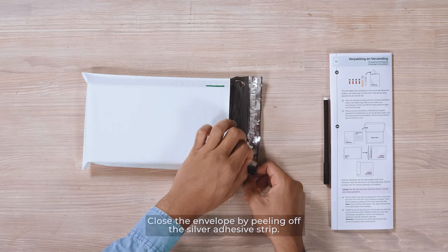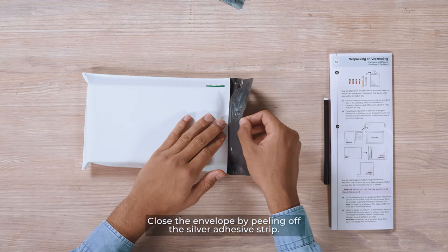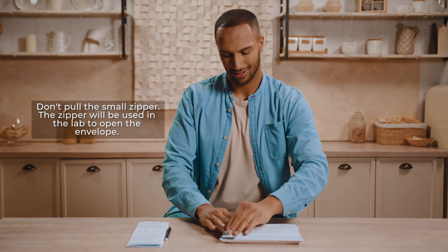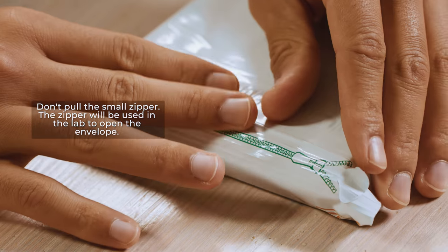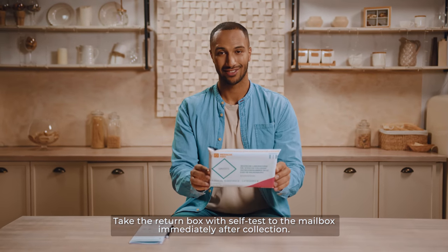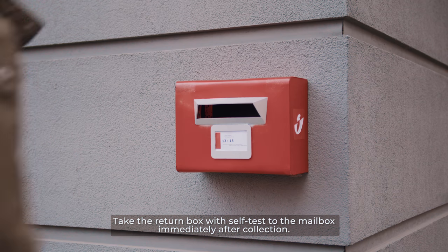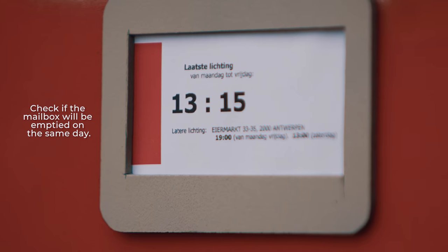Put the return box in the shipping envelope. Close the envelope by peeling off the silver adhesive strip. Note: don't pull the small zipper — the zipper will be used in the lab to open the envelope. Take the return box with the self-test to a PostNL or BPOST mailbox immediately after collection. Check if the mailbox will be emptied on the same day.